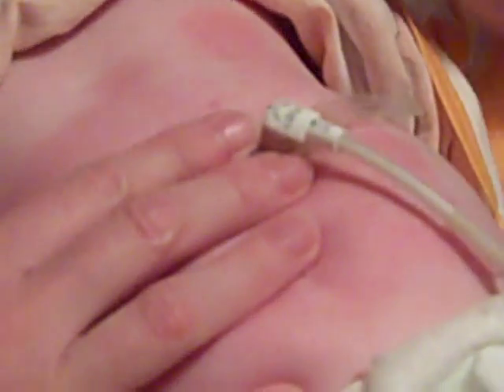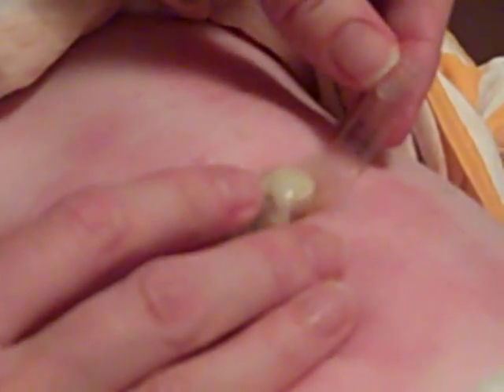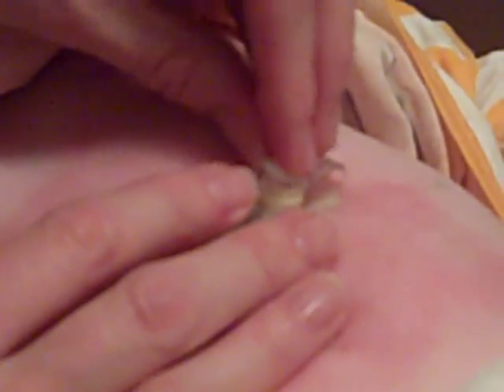And I'm going to hold this down. I'm going to twist this. I've got to be prepared because as soon as I pull this off, then we've got stuff that can come out like that. That's stuff coming out of his tummy. So I'm going to take this and I'm going to plug it. And then I'm going to take my paper towel and I'm going to do this.